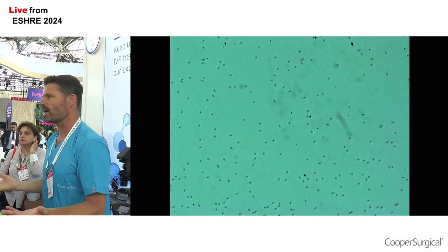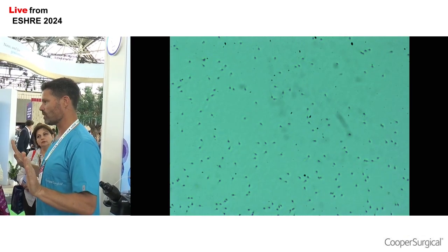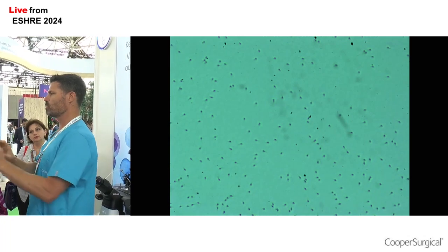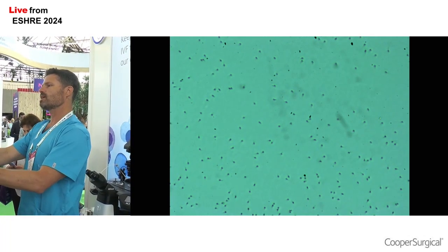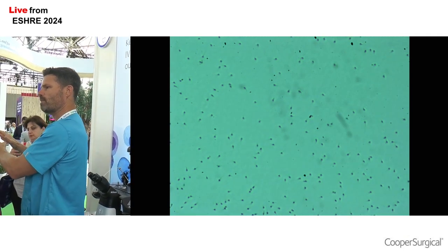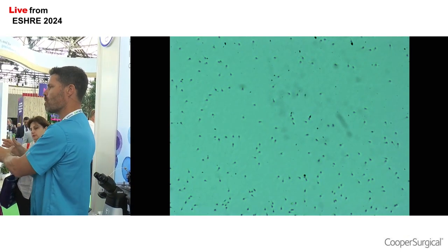And let's say, for example, if I had 5 eggs, I still don't have the eggs in the dish, okay? We leave that to the last minute. If I had 5 eggs, I would select between 5, maybe 7 sperm, put them in my PVP drop, take that dish back, warm it up, give it another 10 minutes to warm back up in the incubator, make sure everything's at the right temperature, then put our eggs in, and then we have our sperm already selected.